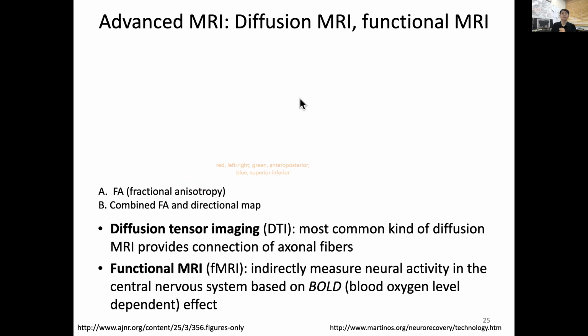So now I want to discuss it. This is a brief introduction. I think for a more advanced or deeper level, you have to read books or resort to other classes. But here I want to introduce you. MRI is really like programmable, which means it doesn't provide this image contrast by itself.